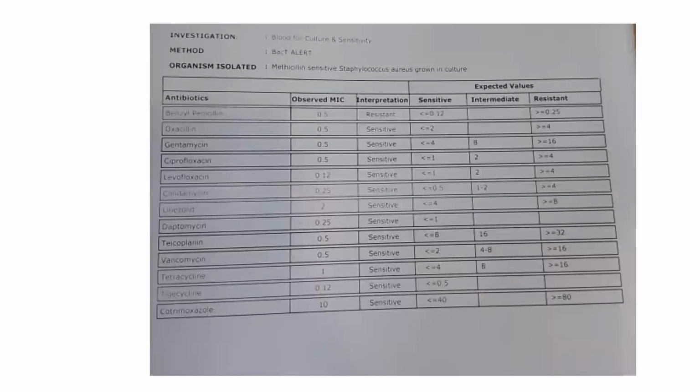So I'll again go back to the very first report that we were talking about. In this report, there is a panel of antibiotics, right? And this is most likely an automated machine like a Vitek or something. So my question is, who chooses this panel of antibiotics? Is it the card which has got a fixed set of antibiotics? Yes. So the card is chosen by the microbiologist, and each card has a set of antibiotics based on the morphology of the bacteria. Let's say, like I told you, gram negative first. So if you have a gram-negative bacteria which is lactose fermenting, then they will choose a type of card which has a set of antibiotics which is supposed to be reported for that bacteria.